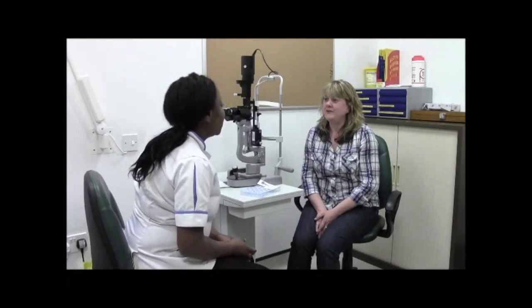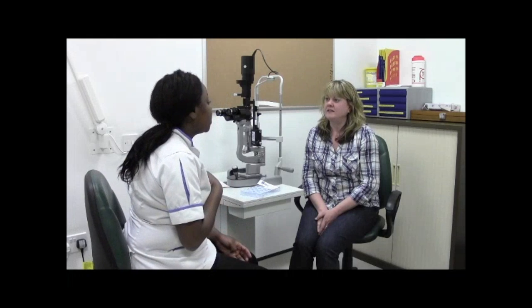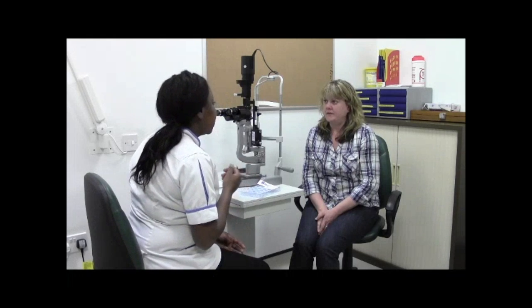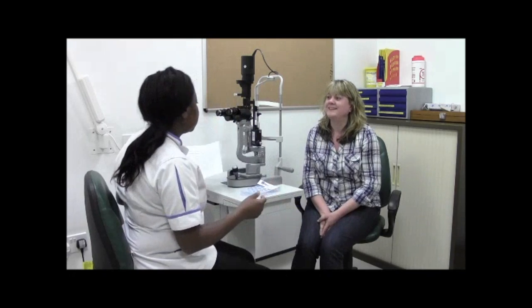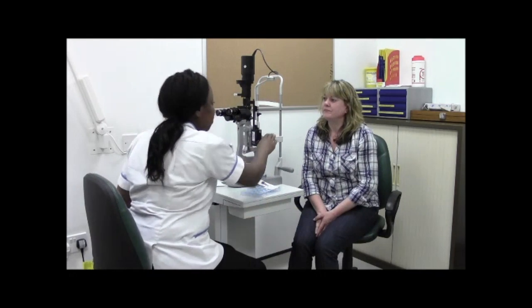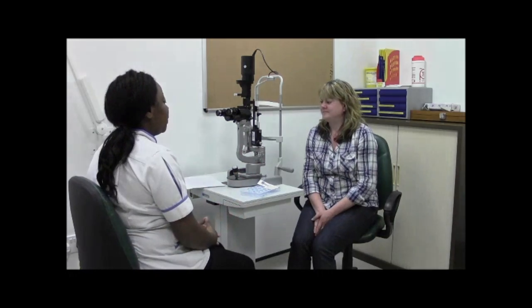Once the patient has been called into the area, you should always introduce yourself and check the patient's name and date of birth to ensure you have the correct patient. Explain the procedure to the patient, ensure that they understand, and take verbal consent. Also allow time for the patient to ask any questions.